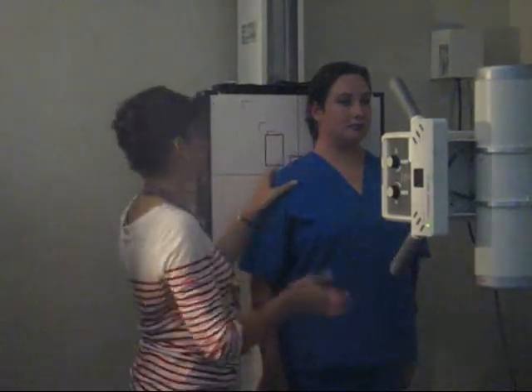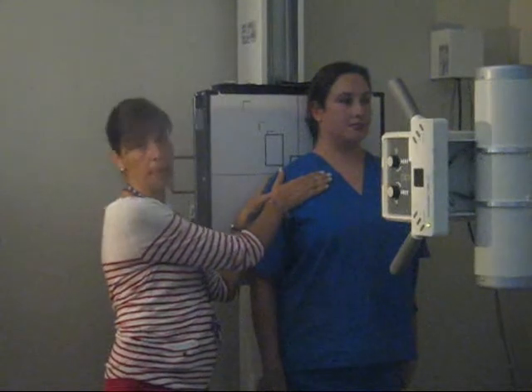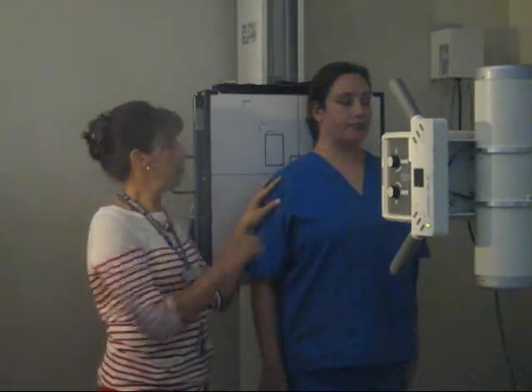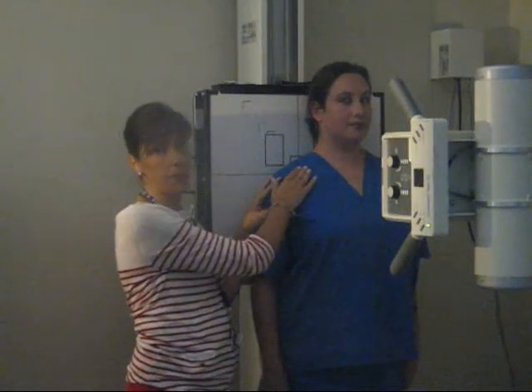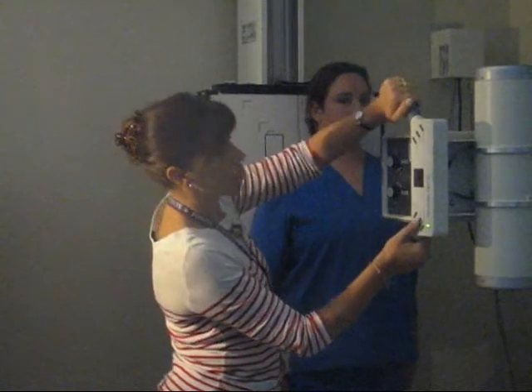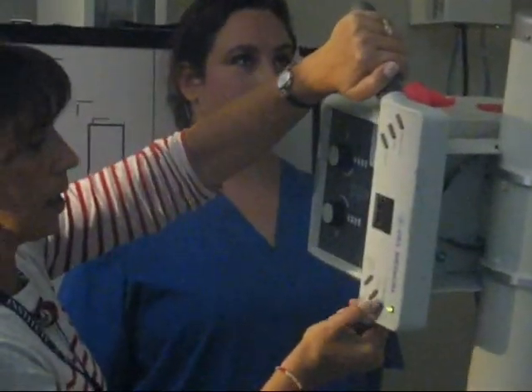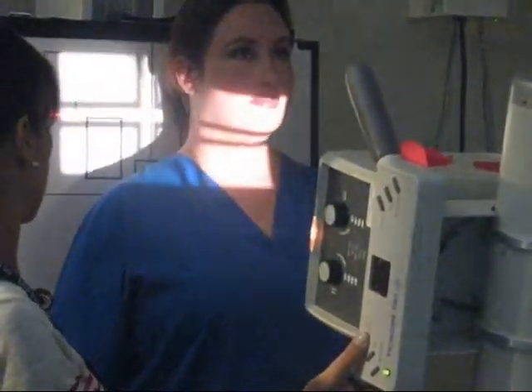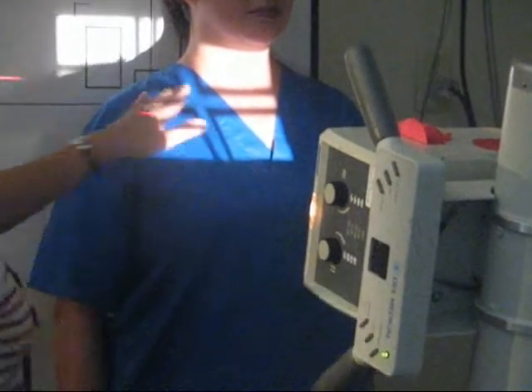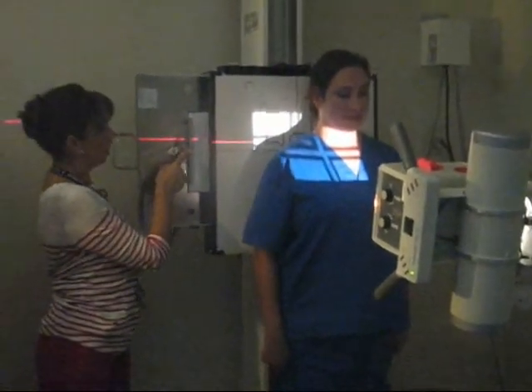If you're going to do AP projection or AP axial, you're going to want to angle the tube about 15 degrees cephalad towards the head. So let's roll our tube 15 degrees. And we're going to bring it to the clavicle, and we're going to have to compensate here.